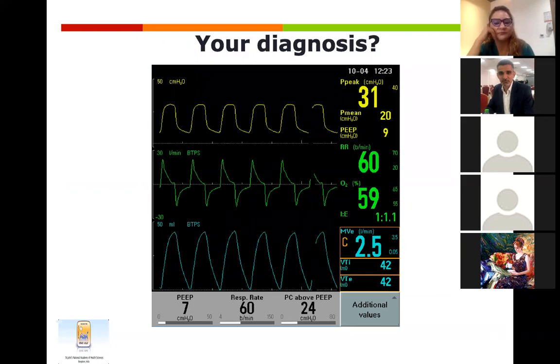What is happening here? Shouldering. Yeah, auto-PEEP. Again here, your expiration is not reaching the zero. So here your expiratory time is less, and this is leading to your auto-PEEP. If you see here, the expiratory deflection changes, and if you make a line straight, you will see that the expiratory time is less. Here the expiration has not reached zero, so you have to increase your expiratory time.